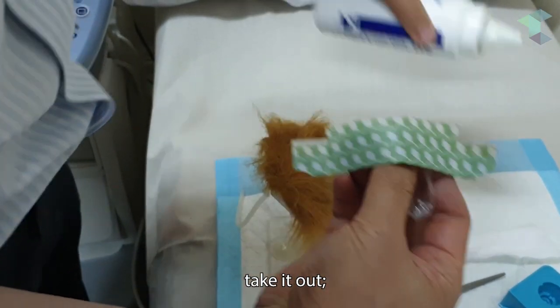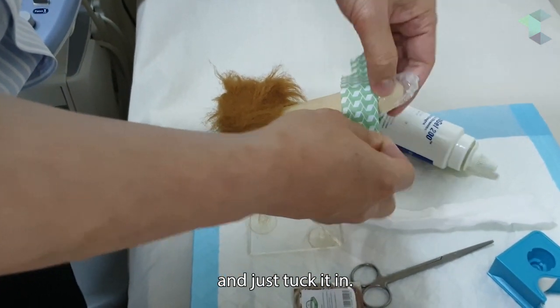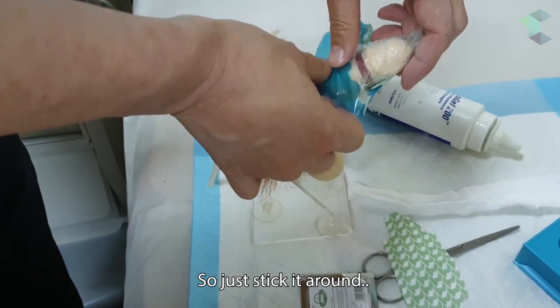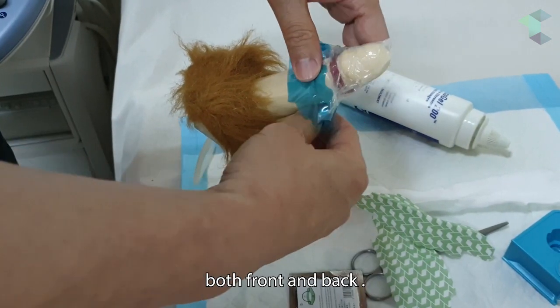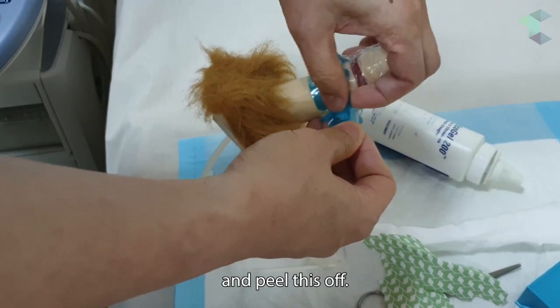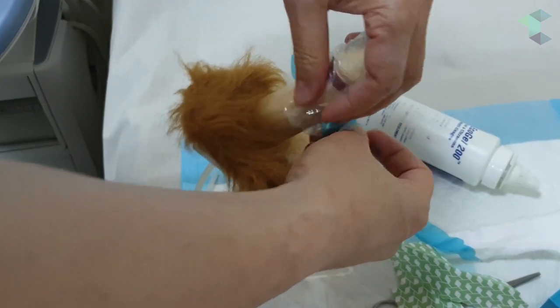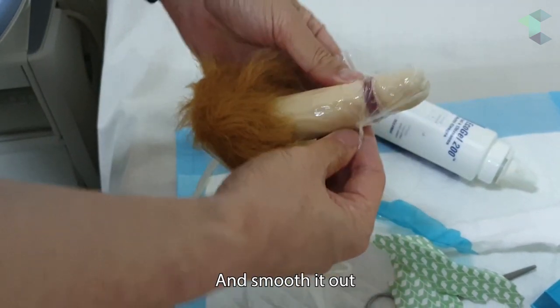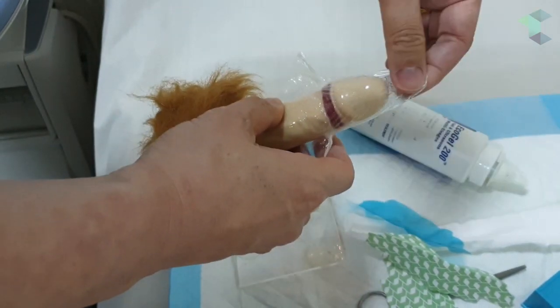Squirt it in, take it out, spread it around, and just tuck it in — we don't have to go all the way. Stick it around both front and back, making sure it sticks on really well, then peel this off. This is a hard peel — remove them and smooth it out so it sticks on quite well.